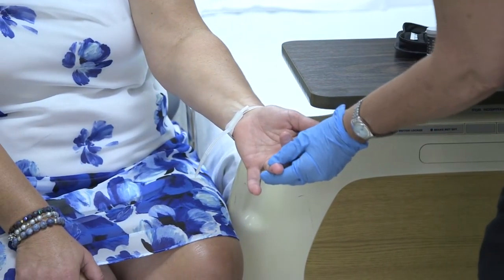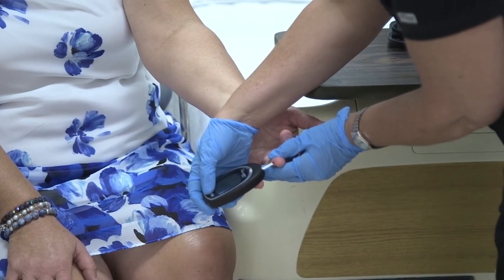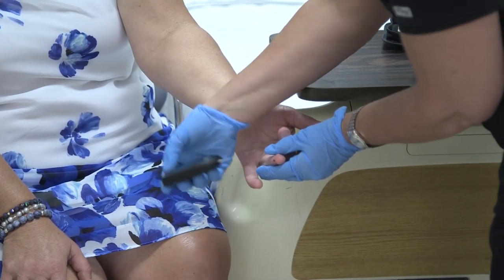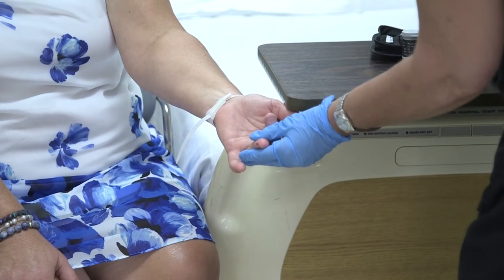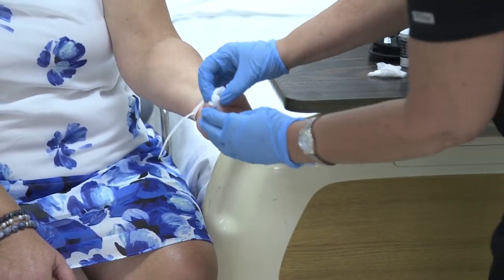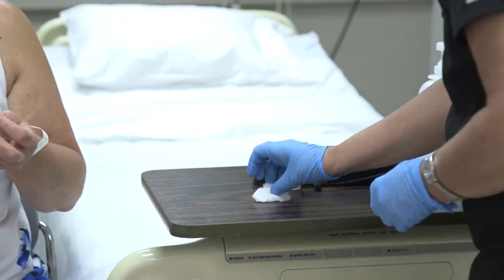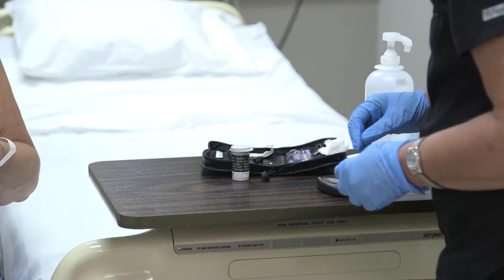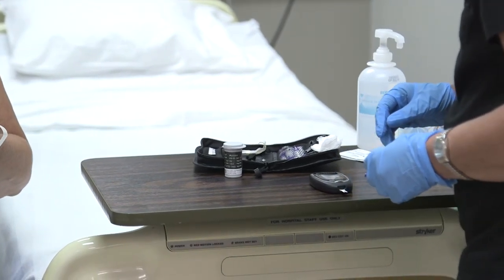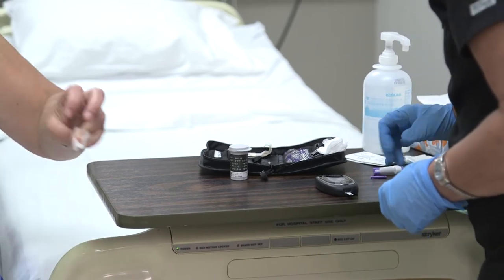We're trying not to massage it because you'll break up the blood vessels, so you just want to gently get the blood out. I'm going to get a new gauze and have you hold on to that. And prior to performing this, I would have also asked if she was on any blood thinners or anticoagulants, just to make sure we know if she's at risk for bleeding more.